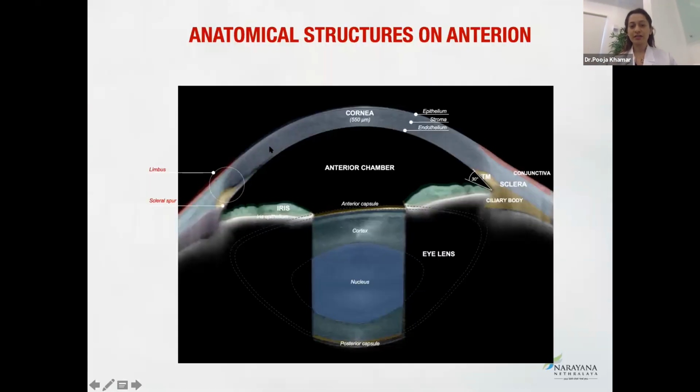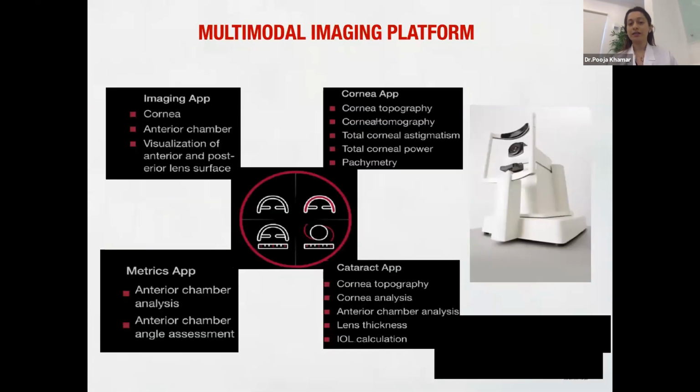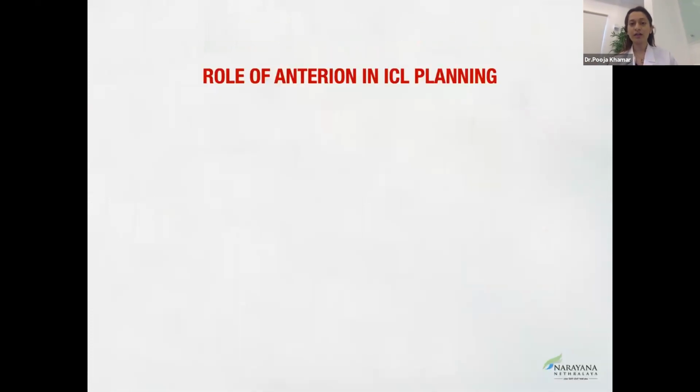This is a very nice high definition OCT itself also. So you can see all the anatomical structures very nicely on the Anterion. These are the 4 imaging apps which you get in Anterion, which Dr. Rohan has already covered. So what is the role in ICL planning?